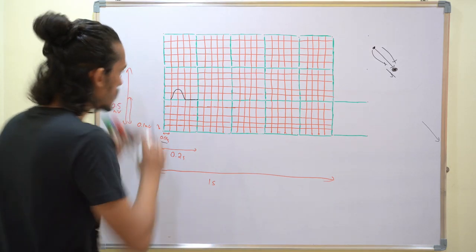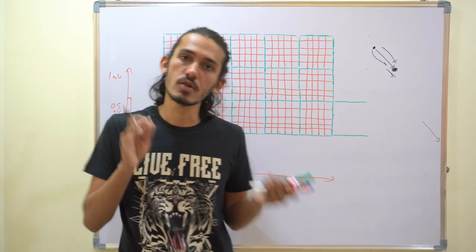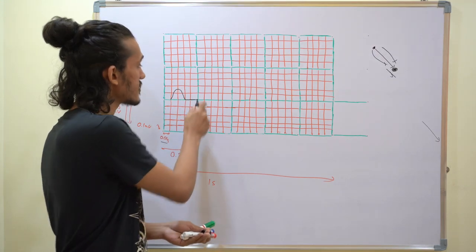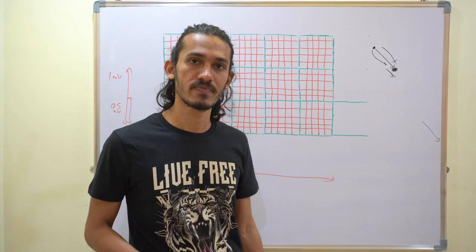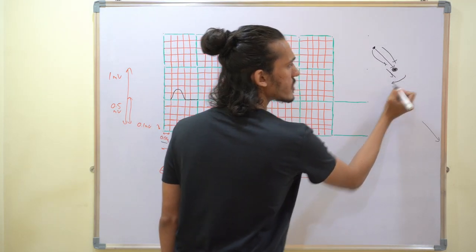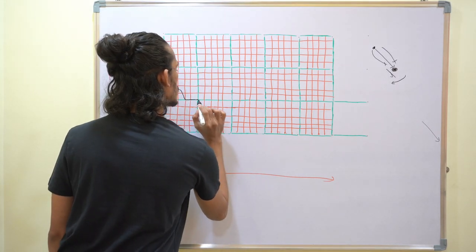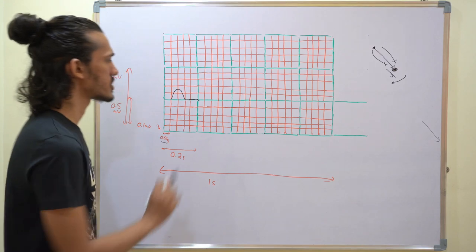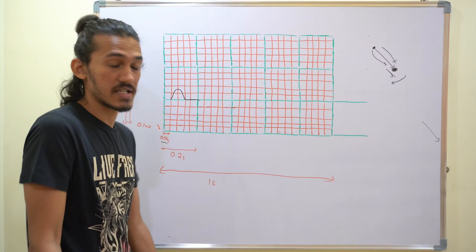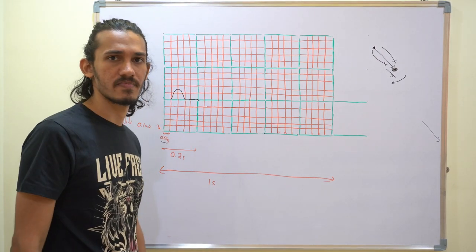Okay. After that, next is your QRS complex. The duration of the QRS complex is again 2 to 3 divisions, as I had mentioned earlier. This is 2 to 3 divisions, this is 1 to 2 divisions, next is 2 to 3 divisions. Initially, we have the Q wave, which is very small because it's going perpendicular. So we'll make a very small Q wave. Usually it will be less than 1 millimeter, less than 1 box, even if it is present. So normally it can be present, but it will be much less than 1 box.